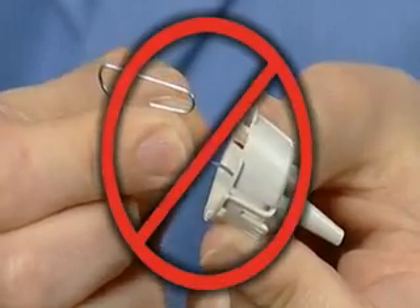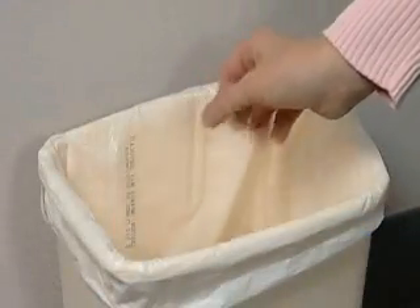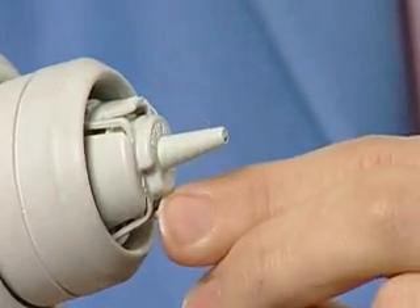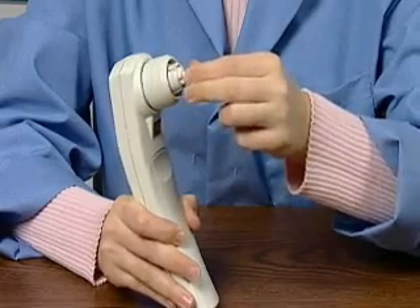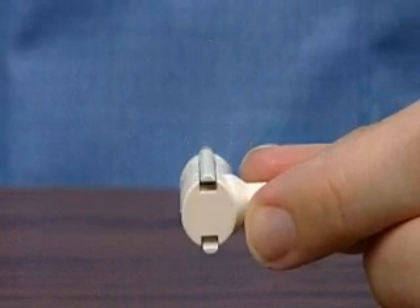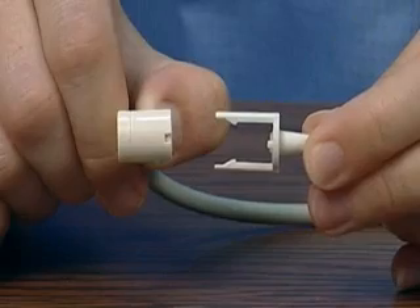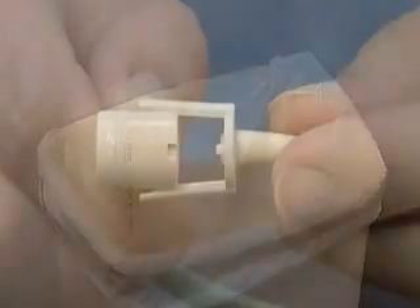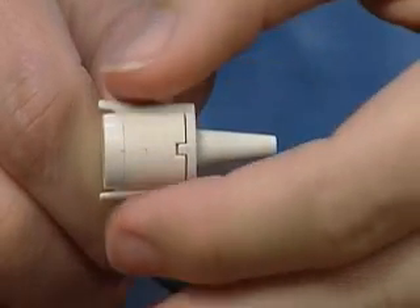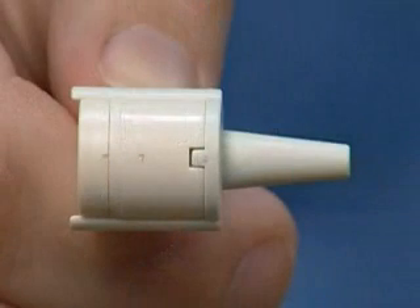To replace the internal probe tip, squeeze the tabs and pull the old tip off, then discard it. Place a new tip on the probe and push down on one tab at a time until it clicks into place. Tug lightly on the probe tip to verify it is securely attached. To replace the tip on the external probe, release the tabs on either side of the probe and slide the tip out. Discard the old tip. Align a replacement tip using the notch on the tip, push it all the way on, then press lightly on the tabs to snap them into place. If seated properly, the tip will be flush with the body of the probe.